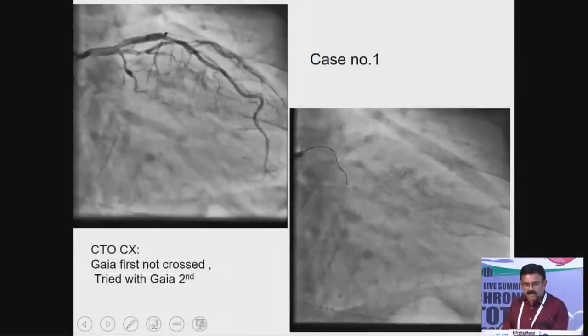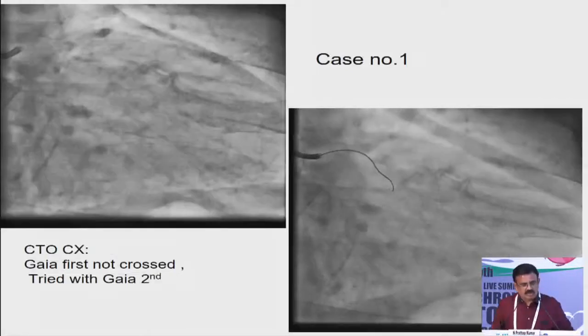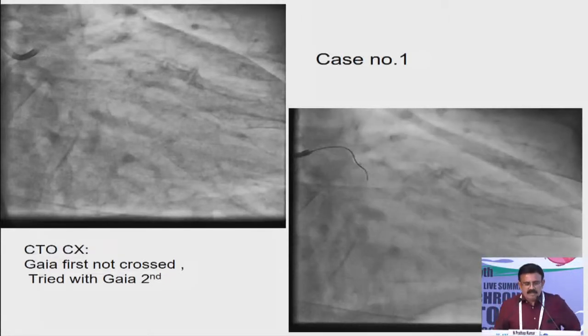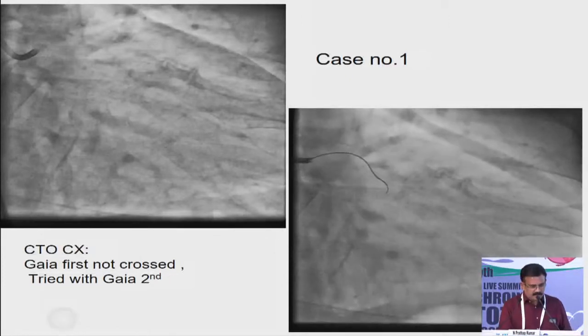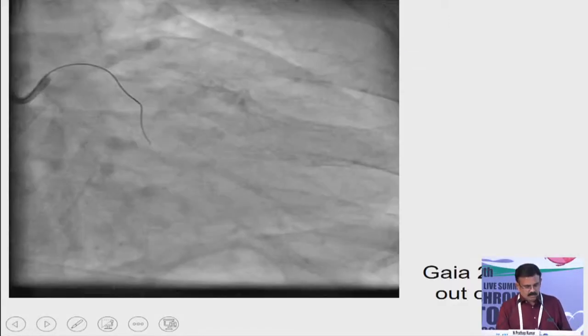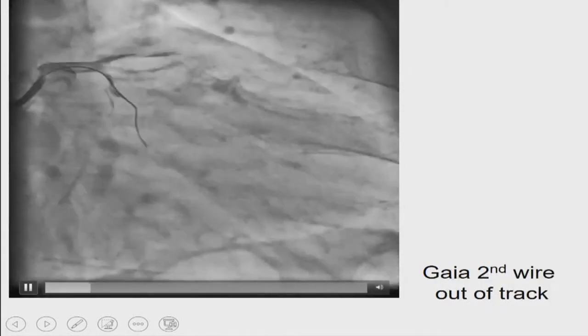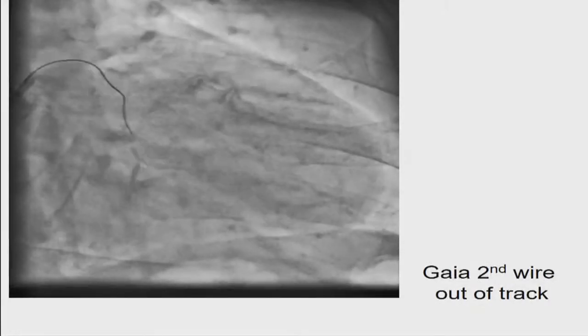So this is case number 1. A CTO of the circumflex, the Gaia First is tried, the wire has not crossed. I tried with a Gaia Second wire. The wire is going somewhere. You can see the wire is out of the track.